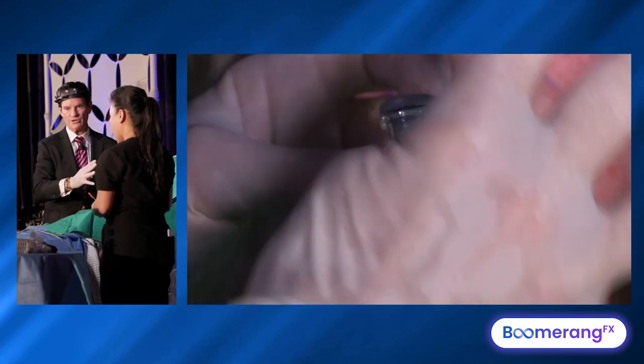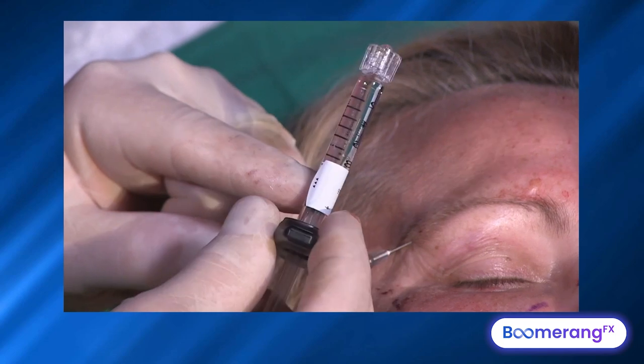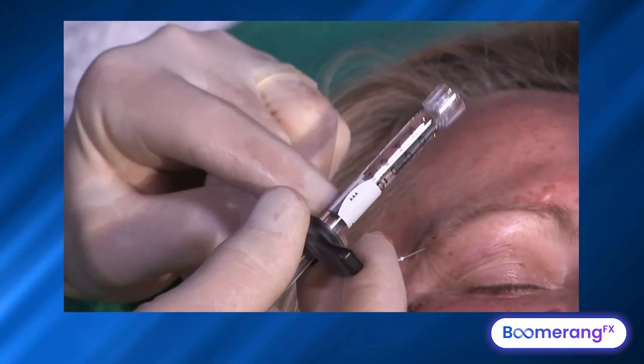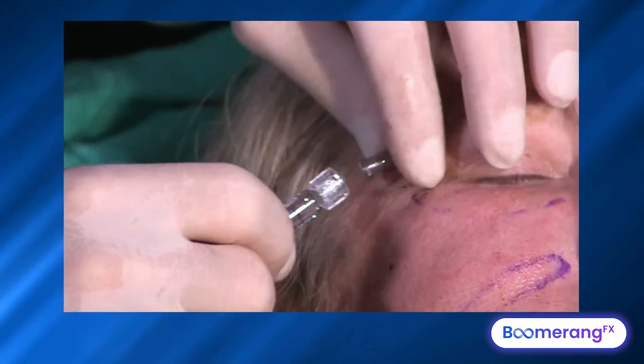I need about four units of Dysport, so it's a four-to-one. This syringe is already 1.2 cc's, and typically there's about 0.1 cc of lidocaine already in here.